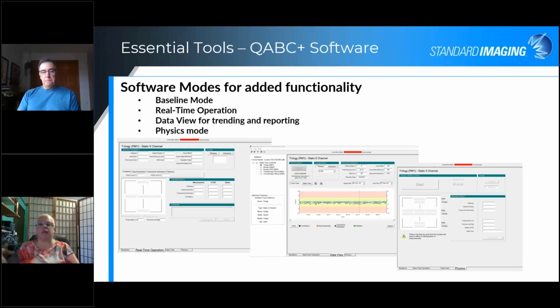So if you're working in this physics mode, maybe troubleshooting an issue with the LINAC, for example, does that end up impacting your trending statistics? No, the work you do in the physics mode is completely separate from your daily measurements. So once you're in physics mode, you do get those results, and you can save those individually, and you can upload those to a separate CSV file, but they don't impact your daily measurements at all. That's fantastic. It really is. It is a sandbox, like you said.